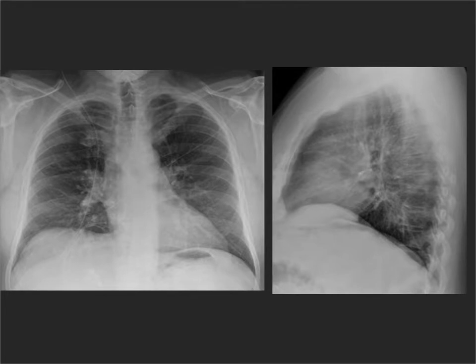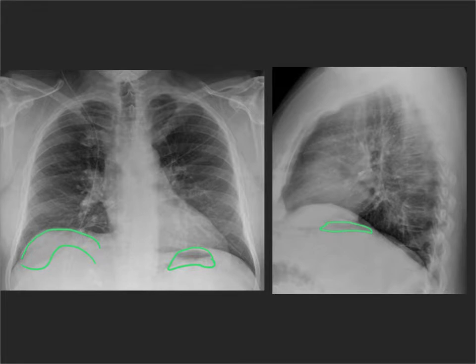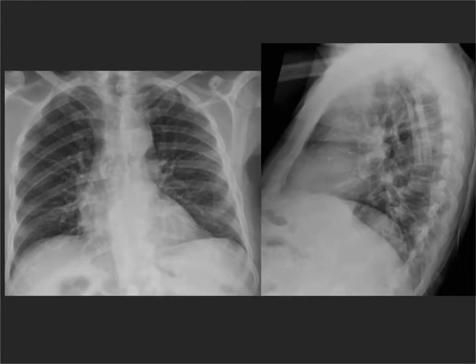Gas bubbles can also be helpful. If you have a nice big gas bubble under one hemidiaphragm but not the other — in this case it's a stomach, but it's not always a stomach — then that can be helpful. Sometimes you have colon up under the left, or a big loop of gas-filled colon up between the liver and the hemidiaphragm on the right, so you always need to check on the frontal radiograph to make sure you know which is which. In this patient, unfortunately, the heights of the hemidiaphragms are pretty similar, and there's no nice gas bubble to help us either.